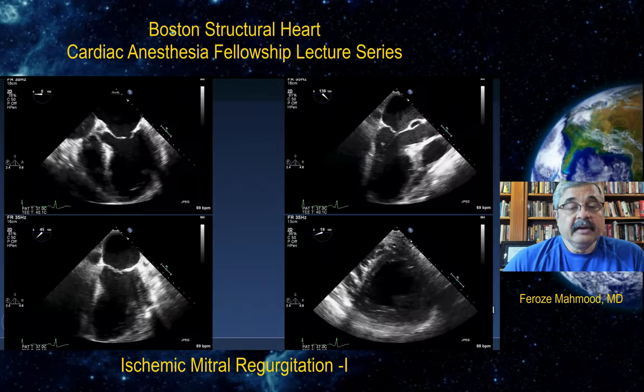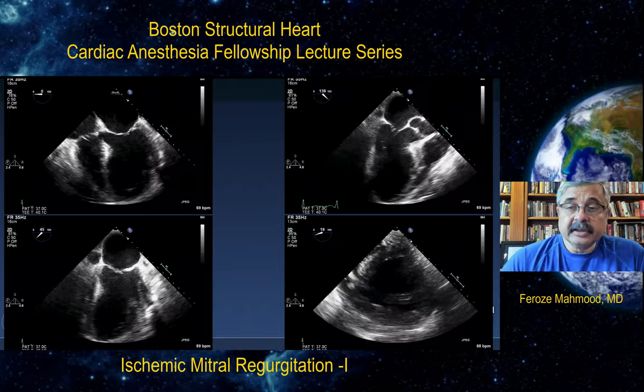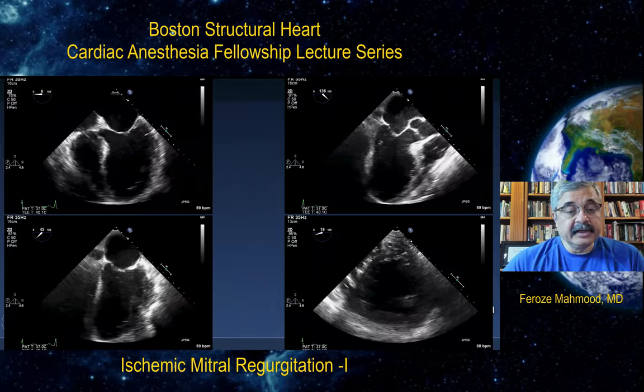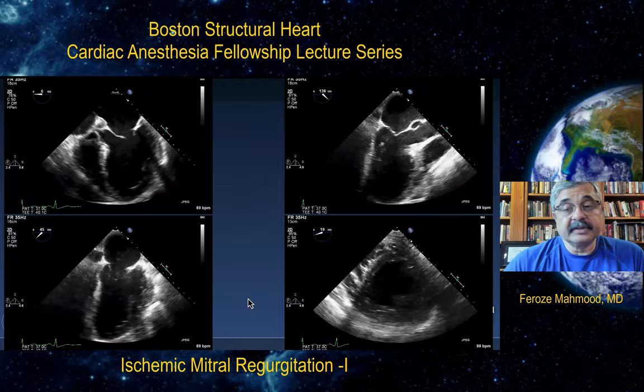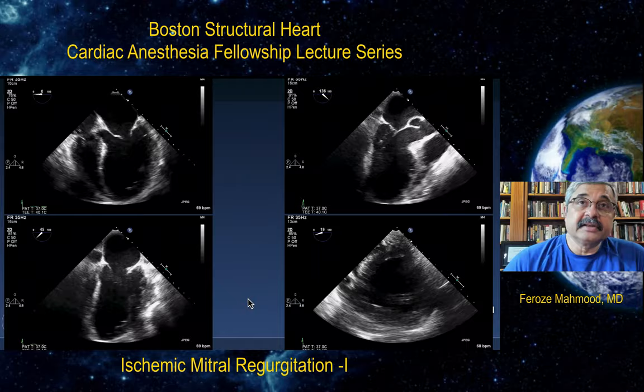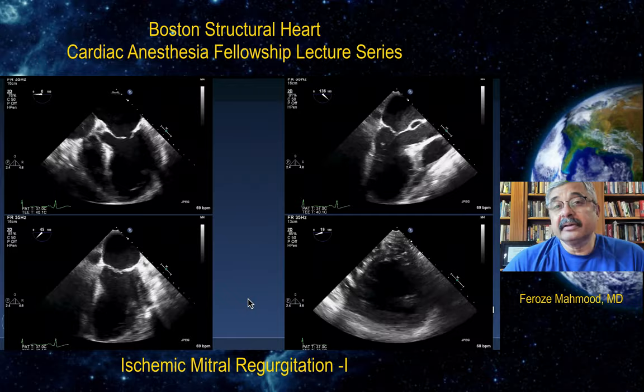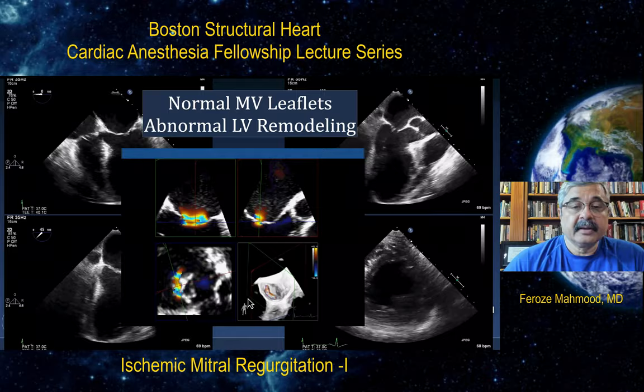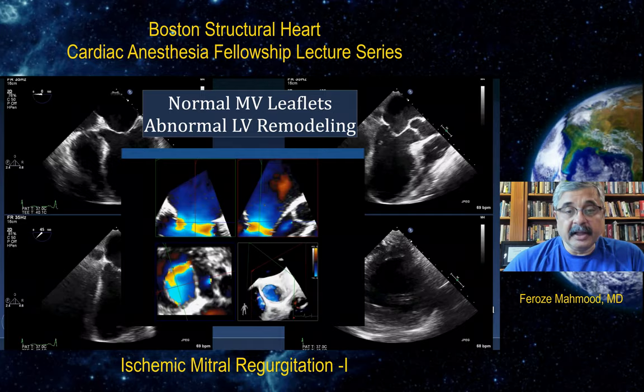Looking at all views of the mitral valve and the left ventricle, it's quite obvious that the leaflets seem to be normal. Particularly the apical and anterior segments of the left ventricle are severely hypokinetic, and the apex is almost akinetic. So it's a problem with the ventricle, reflecting itself as malcoaptation of the leaflets because of imbalance between the closing and tethering forces, leading to significant central mitral regurgitation. Normal mitral valve leaflets with abnormal left ventricular remodeling has led to significant mitral regurgitation.